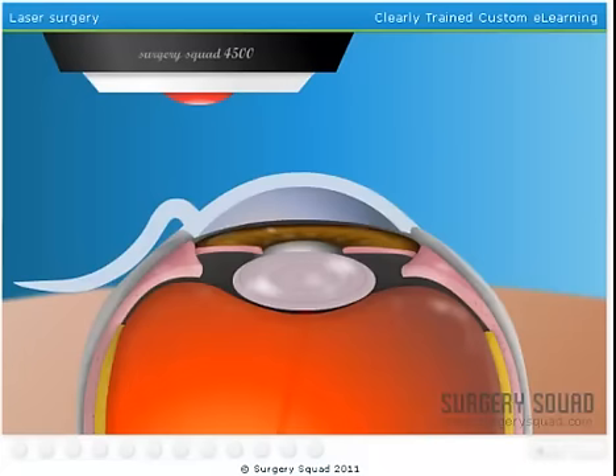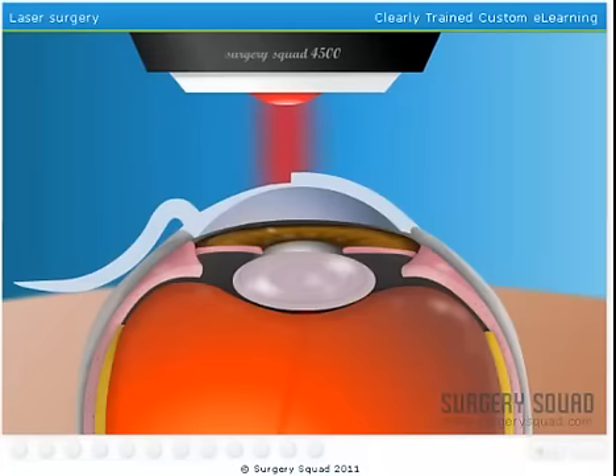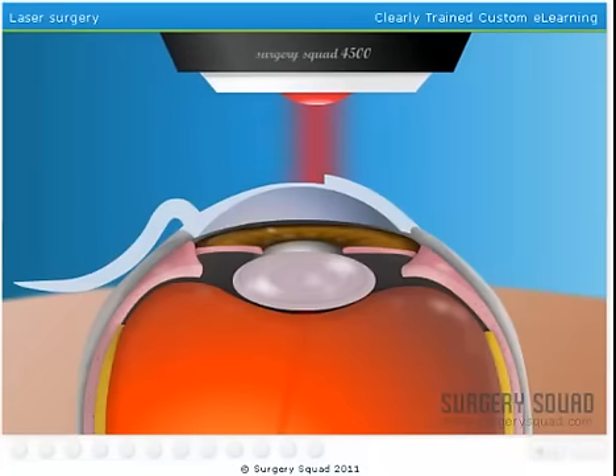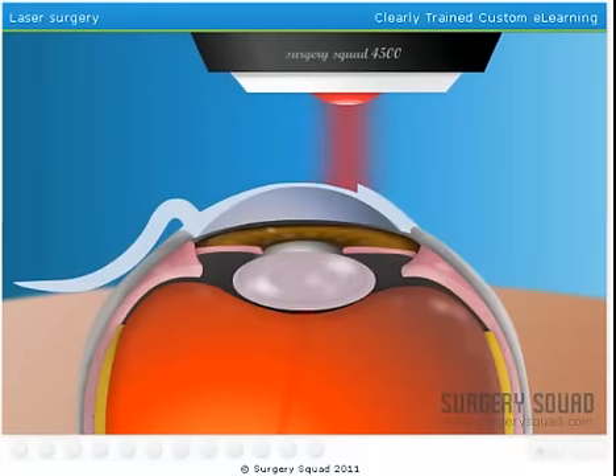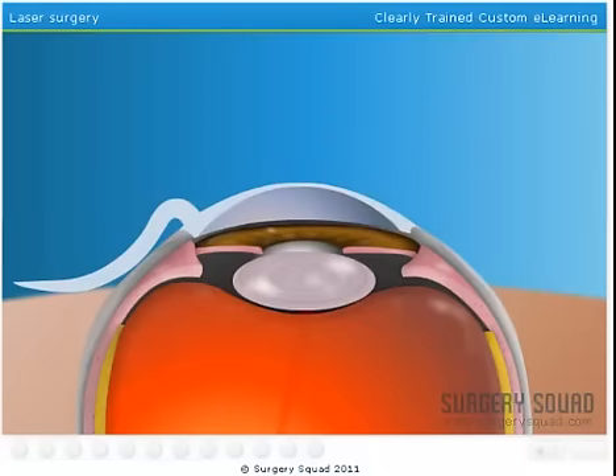A flip of the switch fires up the laser and the reshaping process is underway. Pulses from the laser will correct the shape of the cornea in less than 60 seconds. The laser makes a slight clicking sound and you might notice a faint smell similar to burning hair. And that's it.